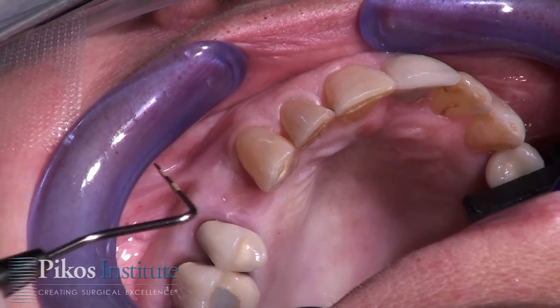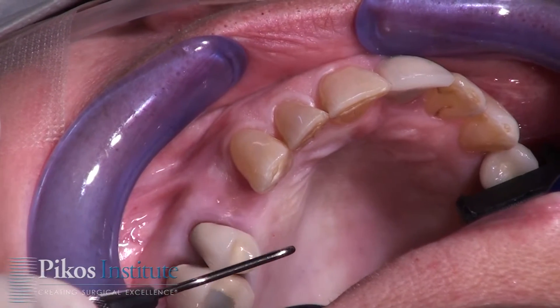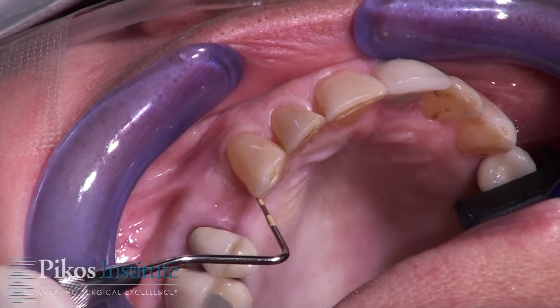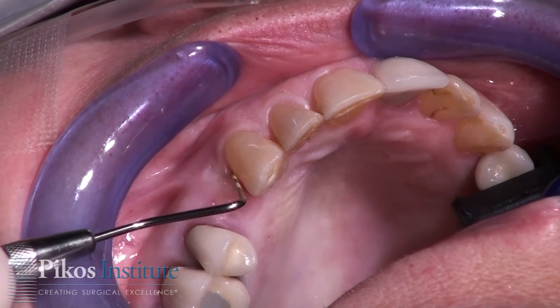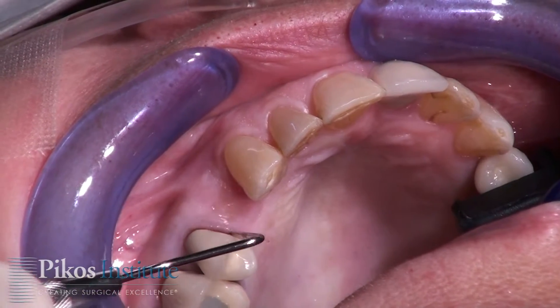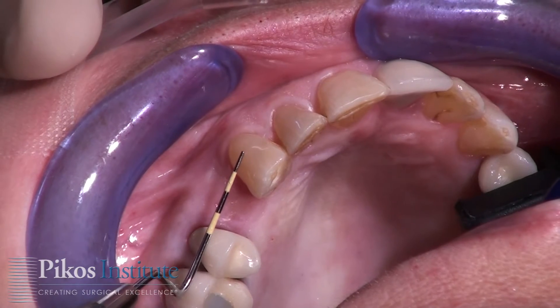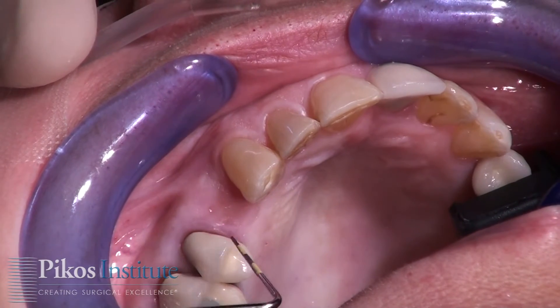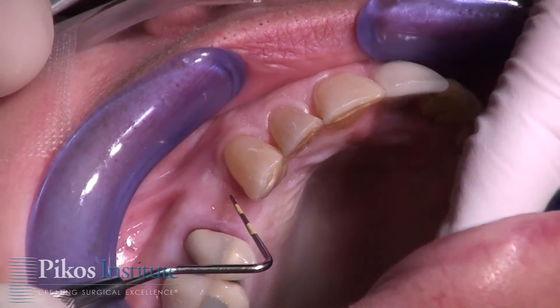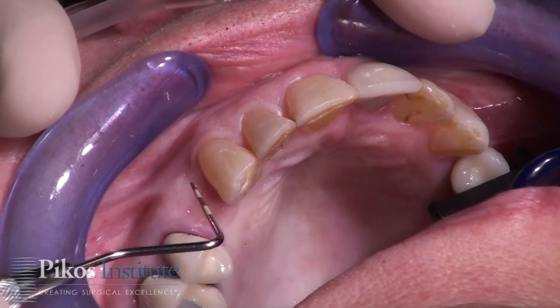My preference here is a mid-crestal and sulcular approach, and by sulcular I mean not just at the crestal area but certainly onto the facial and onto the palate, hence the H configuration. We'll just literally do a full flap reflect to visualize our crest with this H incision, but no release incision is needed here.